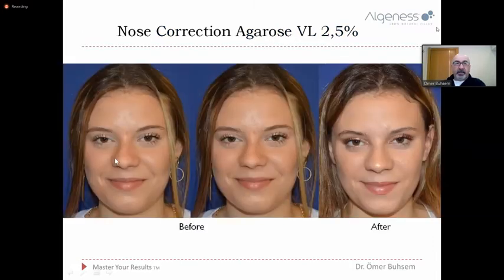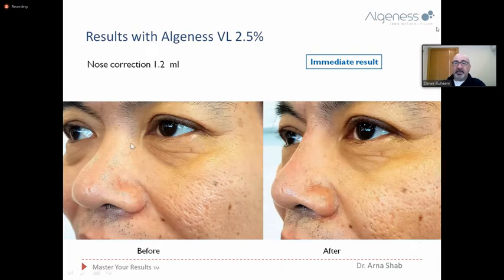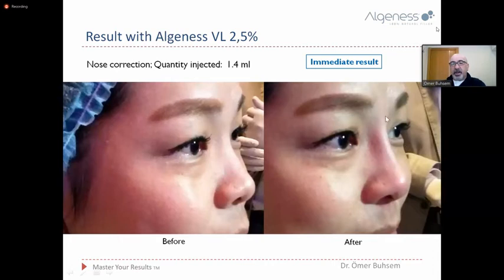Here, another deviated nose. If you inject the other side, the left side, here, you can hide the deviation like this. This is a much better nose, so you can hide the deviations also with this. And this is radix total augmentation with 2.5. This is Arna's case, and it is really a really good material to do these injections, because there is no swelling. You see, it is just like your bone, no swelling. It's a hydrocolloid filler, so it really gives really good contour, shaping, and adds definition here. So really good filler. And this is the immediate result in an Asian patient, the whole dorsum augmentation, and this is 7 months later.